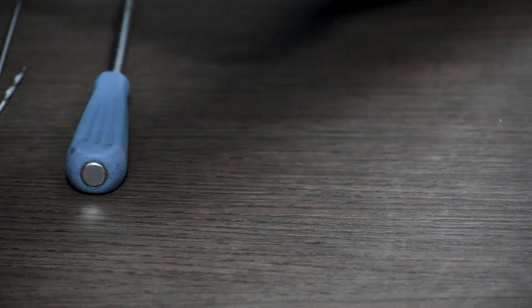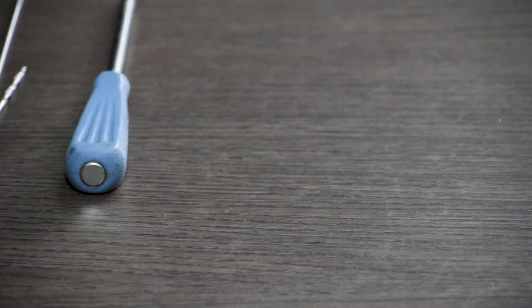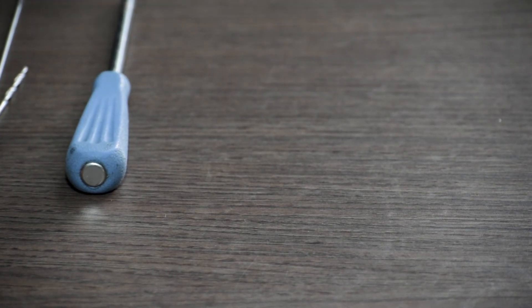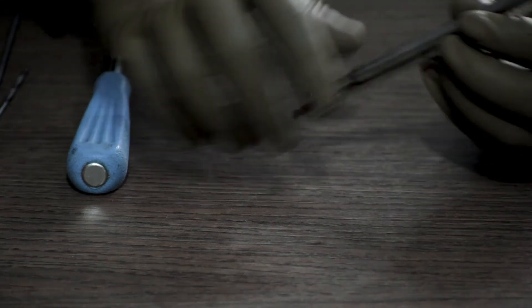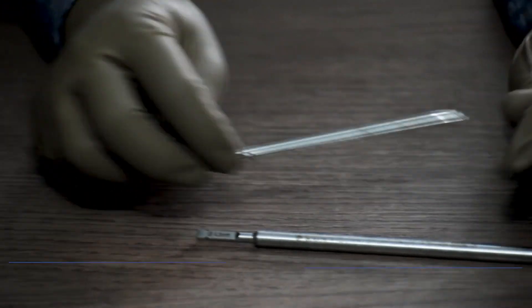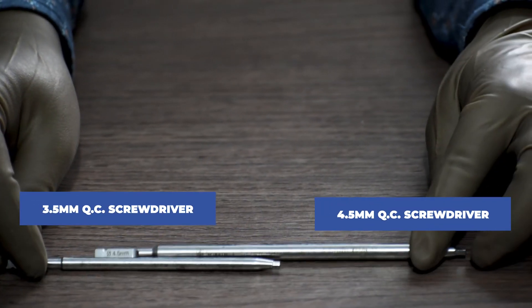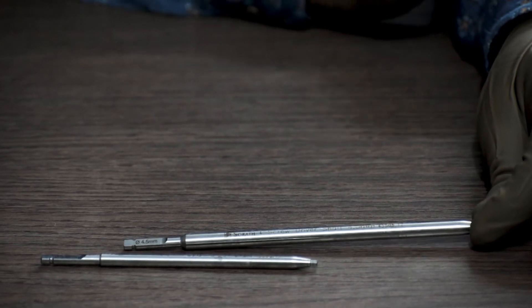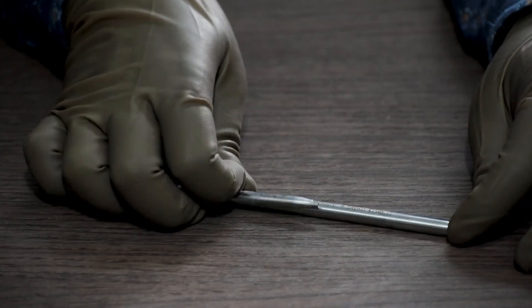At times, surgeons prefer to use screwdrivers with a power drill rather than freehand. In such scenarios, this can be done with the help of a quick coupling (QC) screwdriver — a 3.5mm QC screwdriver for the 3.5mm system and a 4.5mm QC screwdriver for the 4.5mm system. These screwdrivers can be fixed in a power drill and used to tighten the screws.